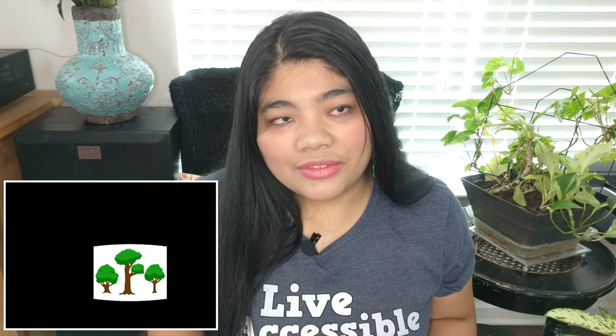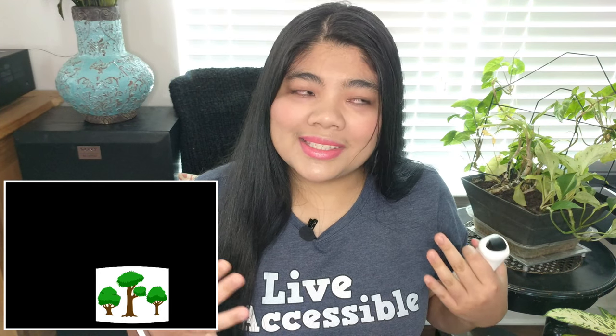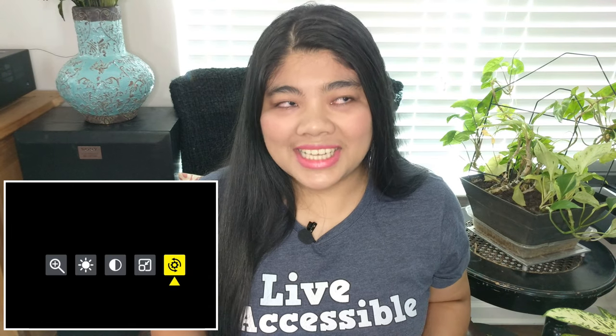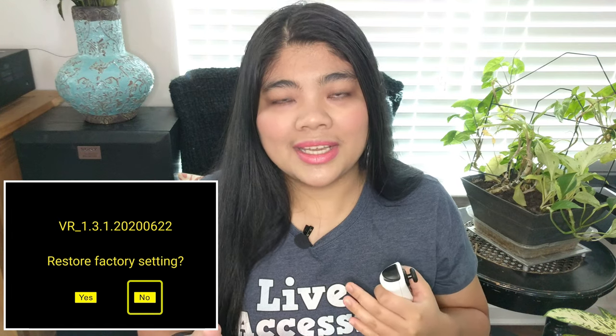This is really helpful for people that have a blind spot or who can see better in a certain area of their vision. The last option is to just reset all the options to factory settings.